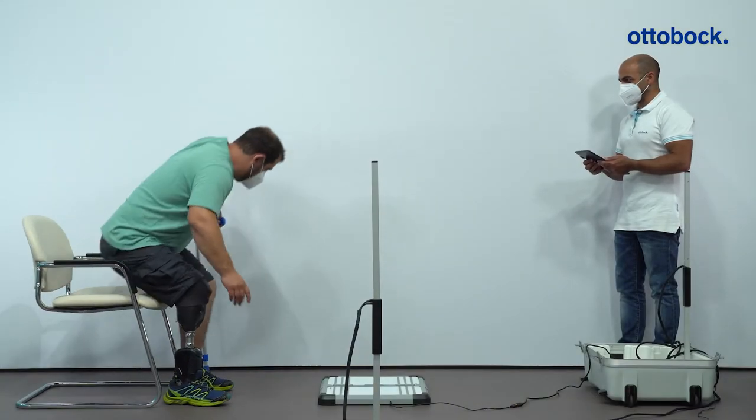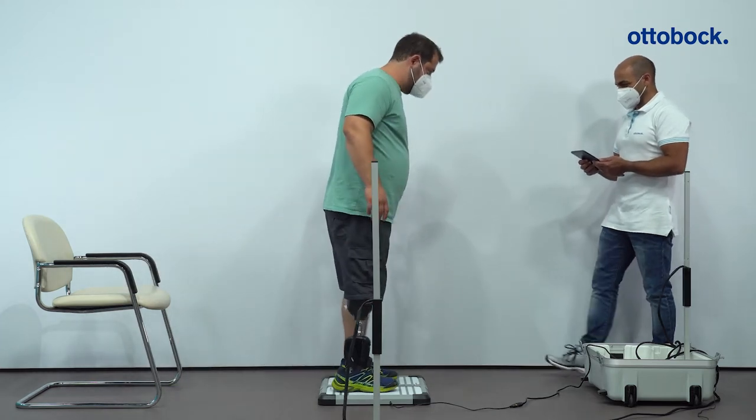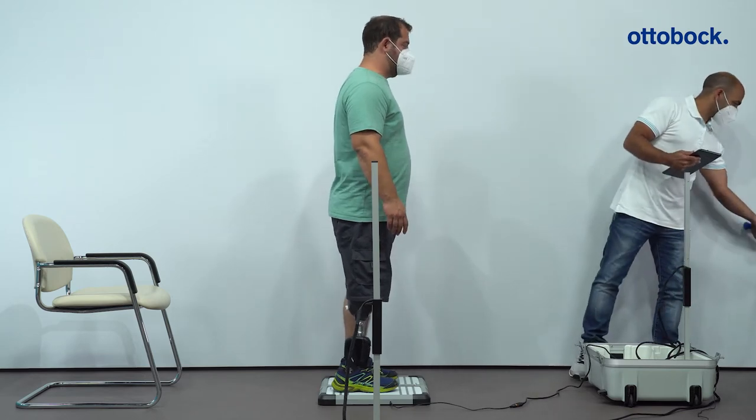For the static alignment and dynamic optimization, the Empower needs to be switched off. Let the user know that the weight of the foot is more noticeable when it's switched off.